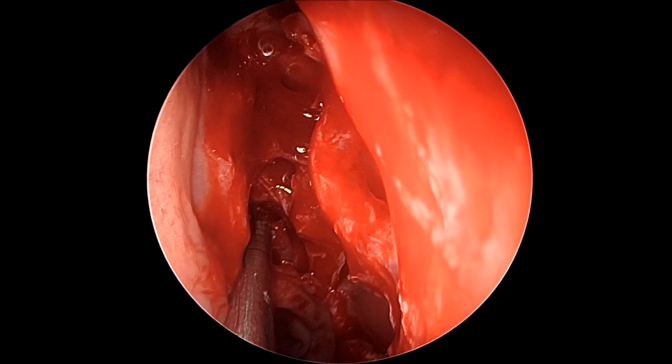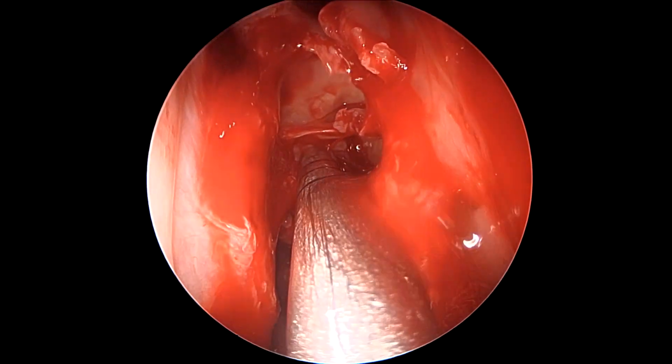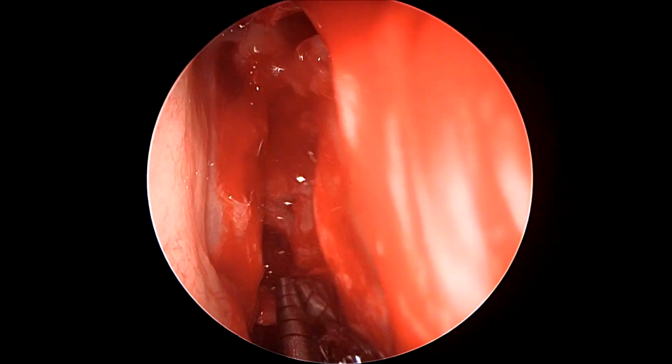Also, this leads to much less mucosal trauma as compared to pulling and avulsing using a Blakesley forceps.